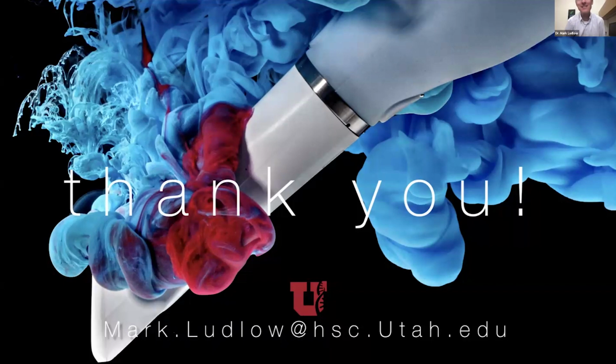Yeah, I mean, that's the thing with the OmniCam. Obviously the Prime Scan is the newer technology, newer hardware. But if you have one, the great thing about the OmniCam and pretty much all of these things is, we get worried like, oh, shoot, I've got to buy this new thing, and then this new one comes out. Well, improvements are made incrementally through software. That's where most of the improvements that we see with the scanner come from, it gets better and better due to the software.